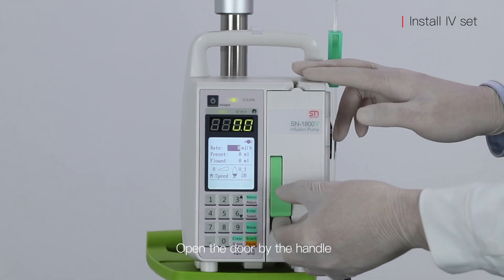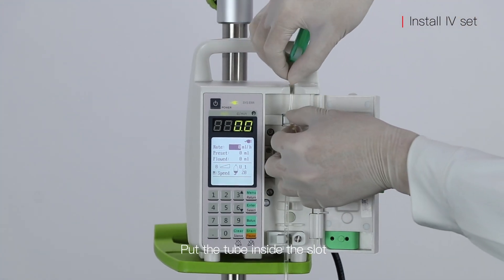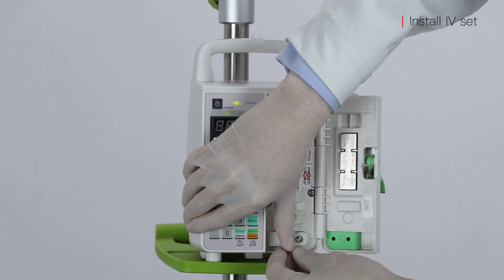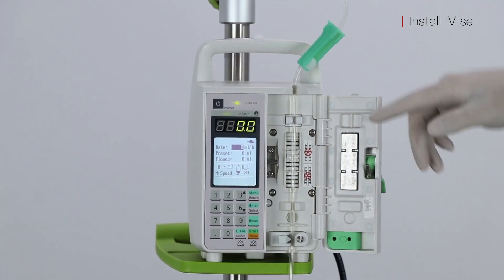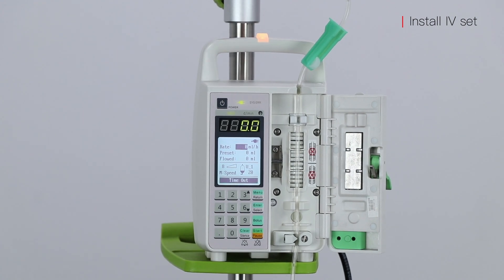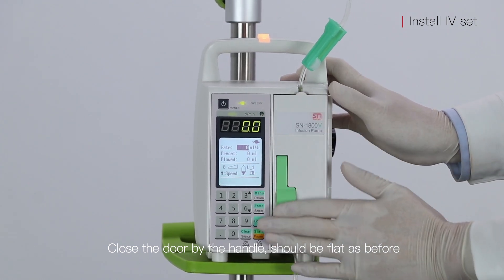Open the door by the handle and put the tube inside the slot. Here is the bubble sensor, pressure sensor, and stop clamp. Close the door by the handle — it should be flat as before.